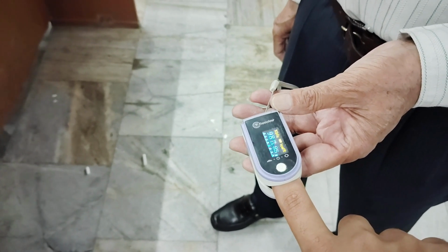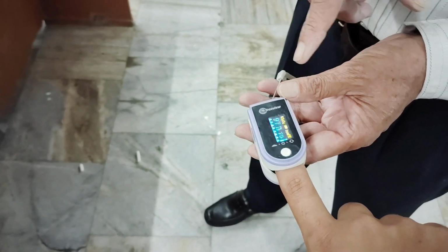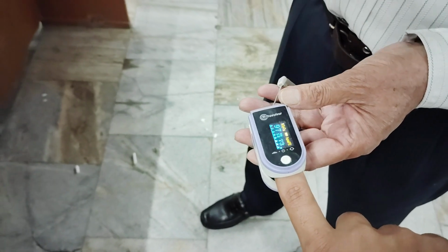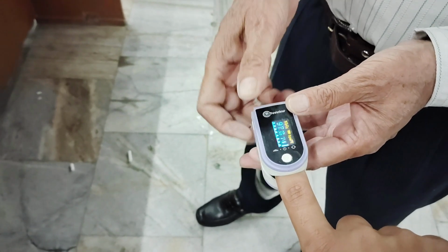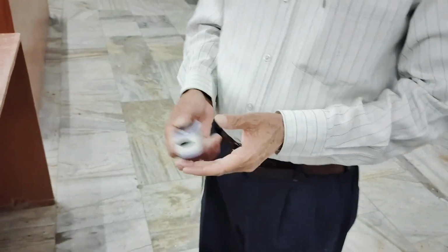Both readings will come here. It shows 98. 98% is the oxygen saturation and 73 is the heart rate, right? So this is how it works. You can also try it on your hand. Very simple but very good information. Oxygen saturation, right?